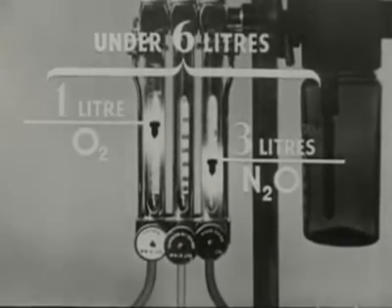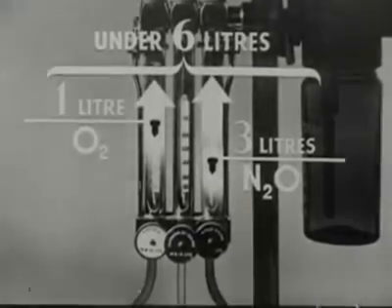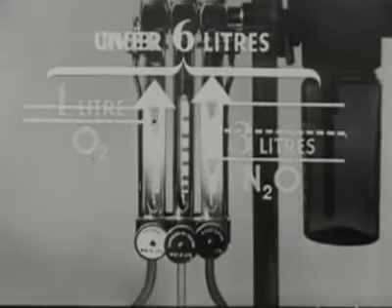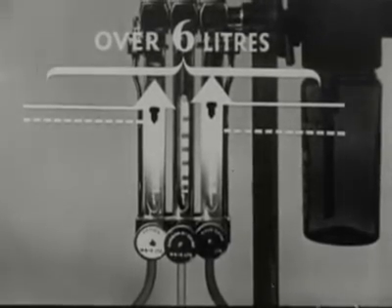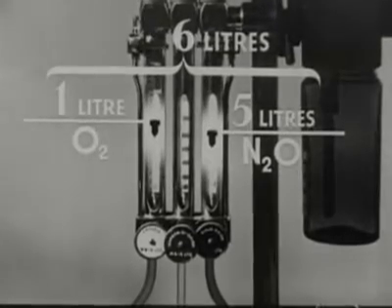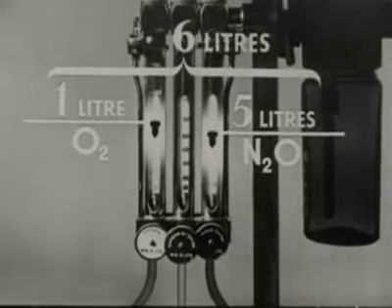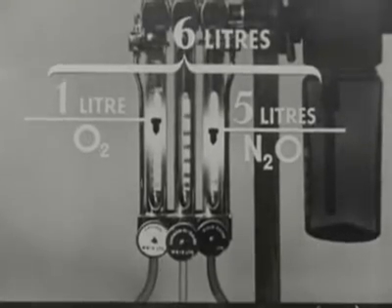Conversely, if the flow of fresh gases is raised, rebreathing will decrease and will cease altogether when the flow is equal to or more than the minute volume of respiration. To sum up, the amount of rebreathing with a flow of 6 liters of fresh gases a minute is not normally excessive, and you should not give less, except when for some reason you want carbon dioxide to accumulate.